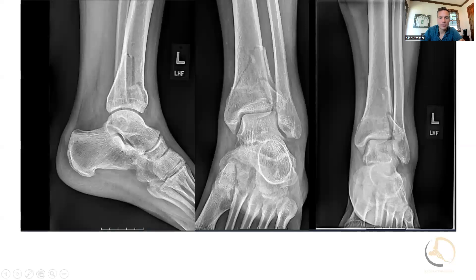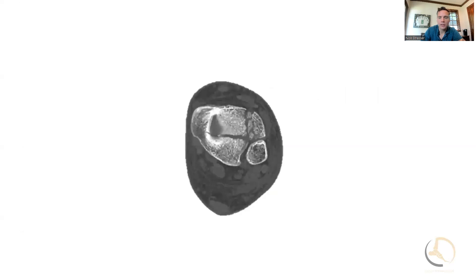This is a case here in which you can see a pilon fracture in a young gentleman. I like to use this view when it comes to pilons to sort out what the approach is going to give me.